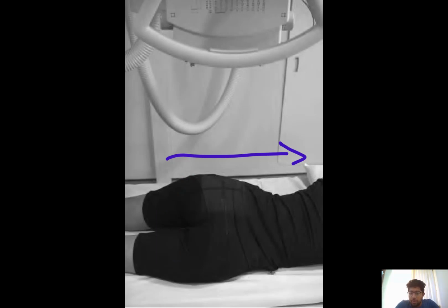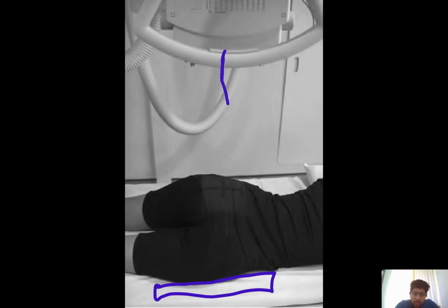and the imaging is done with the cassette placed below the patient, and the centering is done just below the coccyx, and the rays are directed in such a way that they make a 12-degree angle towards the head. 12 degrees of angulation is done towards the head. Centering is done at the level just below the coccyx, and the image receptor is present below the patient. This is how we do Judet's view.